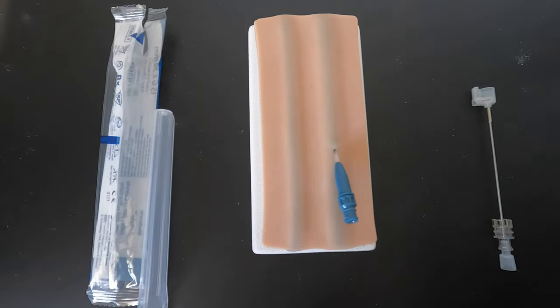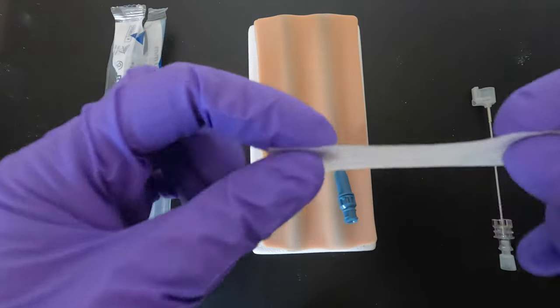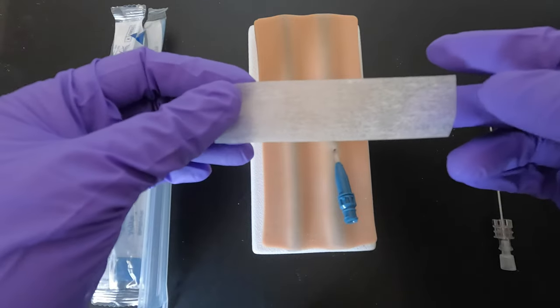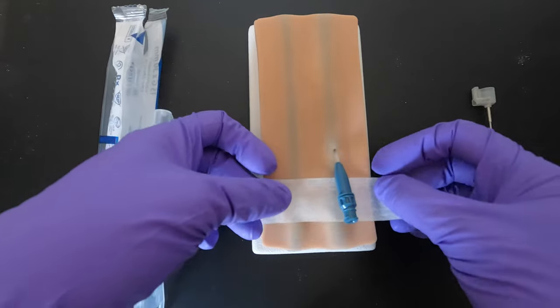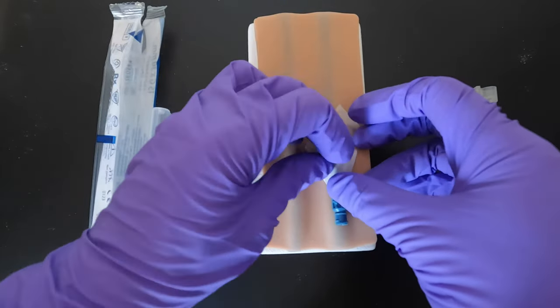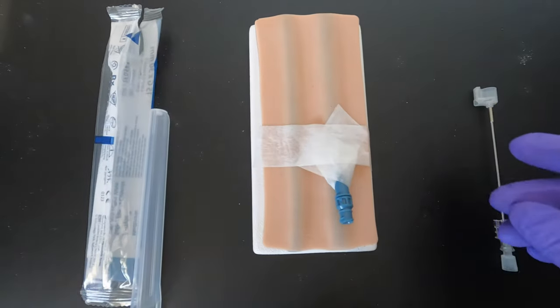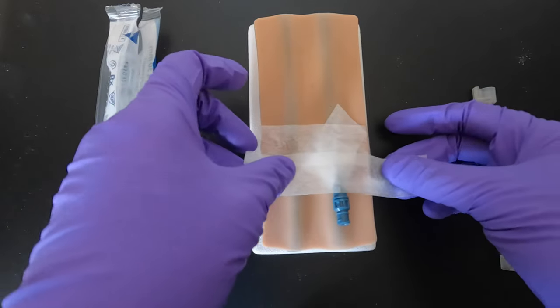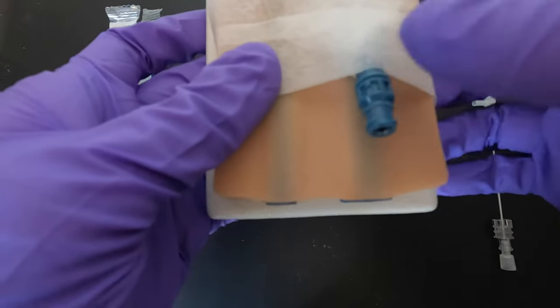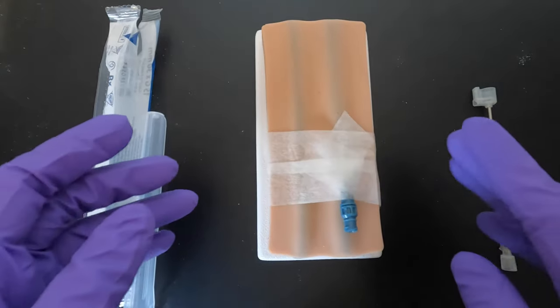I'll show you how to tape it according to the manufacturer's advice. You still use three tapes, and you can use any tape — micropore, duropore, or Hypafix. The recommendation is to go underneath first, then do a crisscross taping. You can use a longer tape if needed, then one on top and another one below. Because what's inside the vein is plastic, not steel, you can press or bend it.